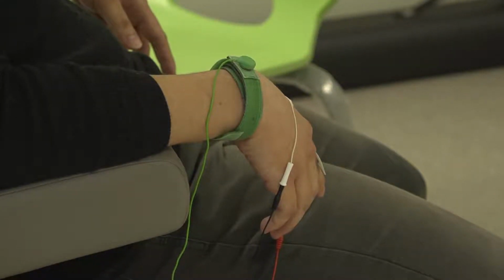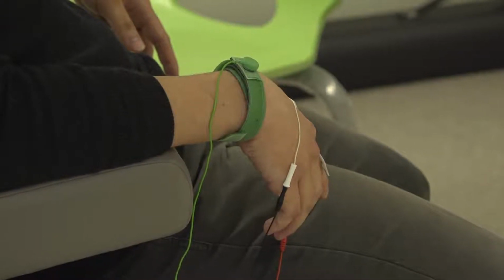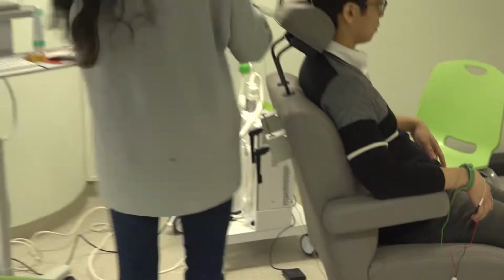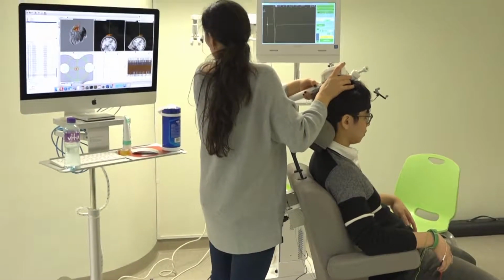Before we saw that the fingers were moving, but I'm not able to reproduce that after a while. So you want to find a spot where you can get this MEP, and it is reproducible, okay? What is this brain site useful for? It tells me the spot I was stimulating, where the position of the coil is. So let's see if I can reproduce it.